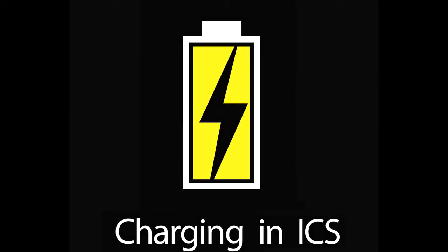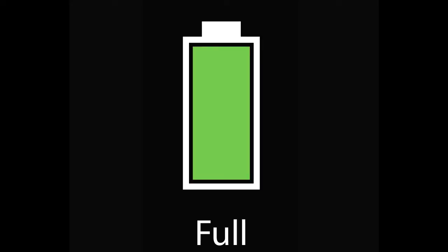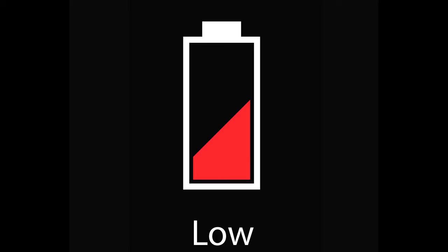With the power on, check the NX battery level by looking at the charger status icon on the lower right corner of the display. The battery icon represents the charge remaining in the battery. A lightning bolt indicates charging is in progress. Green means the battery is fully charged, and yellow means a moderate charge remains.